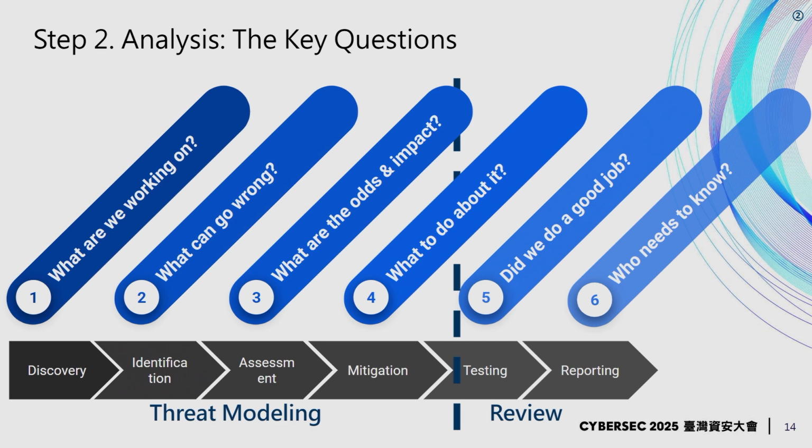Then your controls get into the development cycle, and once this is all performed by the development team, the team will gather again for the review phase. And then the team will ask the question, did we do a good job at it? They will check the testing activity in order to adjust the residual risk. And then package that for reporting and document and communicate the results.